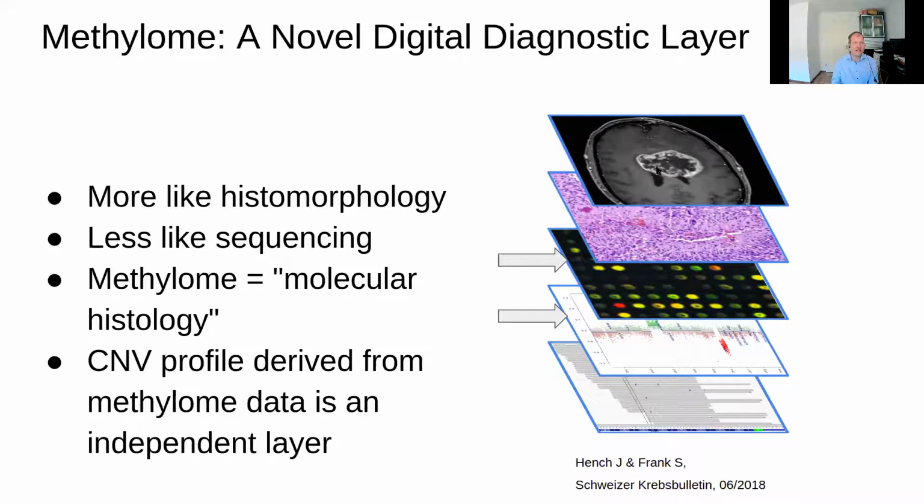So you have a clinical layer that can be complemented by macroscopy or an imaging layer. So you have, for instance, a process that is somehow destructive to the brain. And then let's say you took a biopsy from this lesion, you would see a histological image, which we have heard about today quite a bit, that contains patterns, that contains some information.